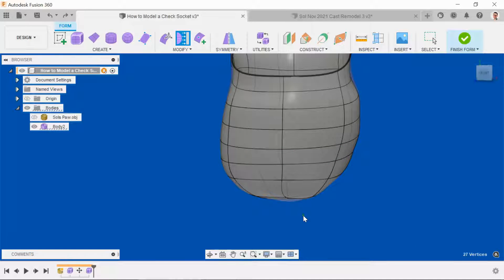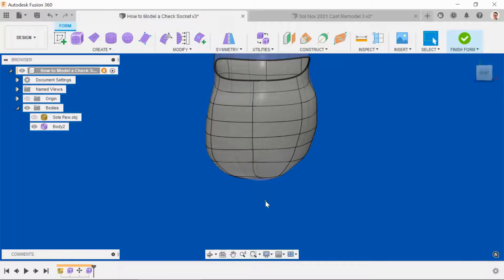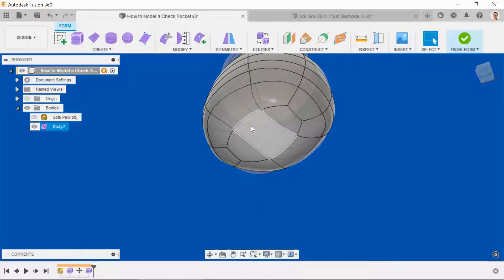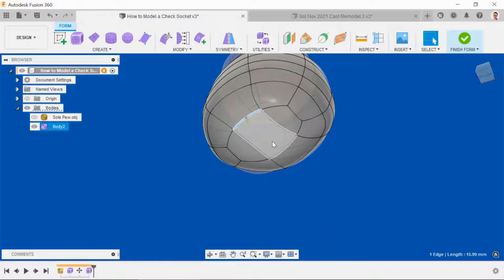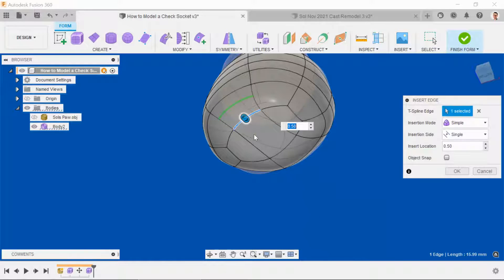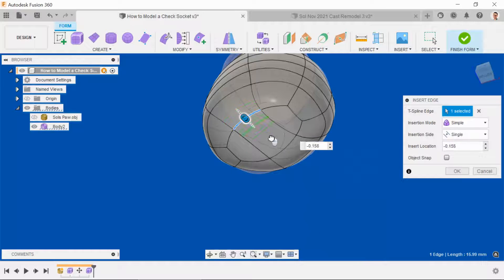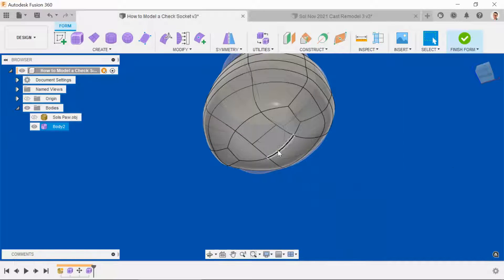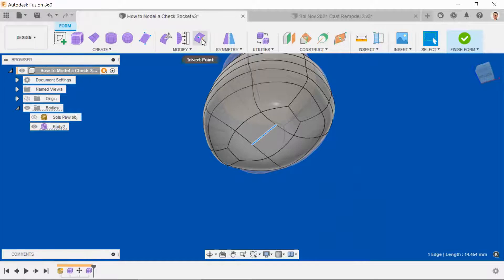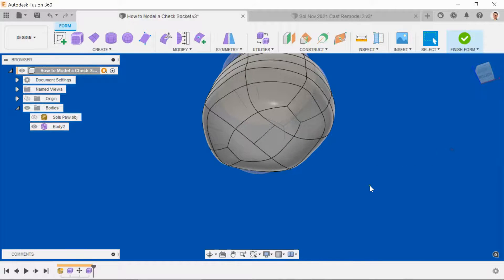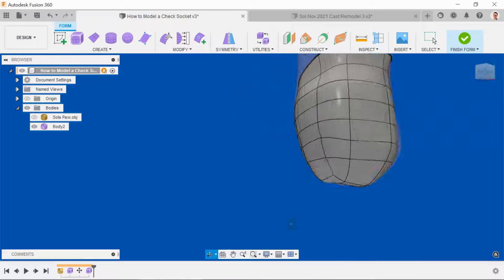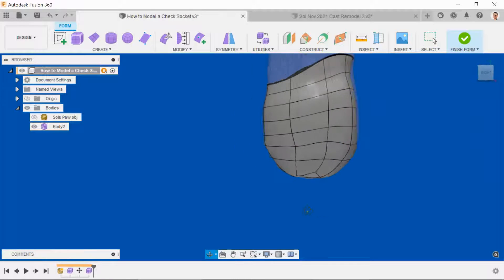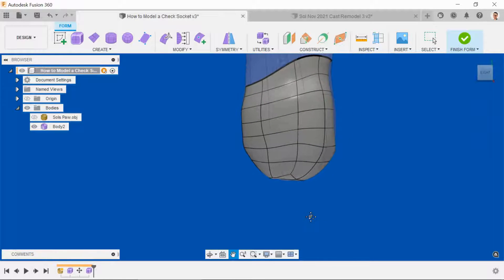In those areas, you can either insert an edge, just highlighting an edge, right-clicking and selecting insert edge, bringing that into the area that you want to use it, selecting it and adding a point as well. Now that changes the geometry locally quite considerably.